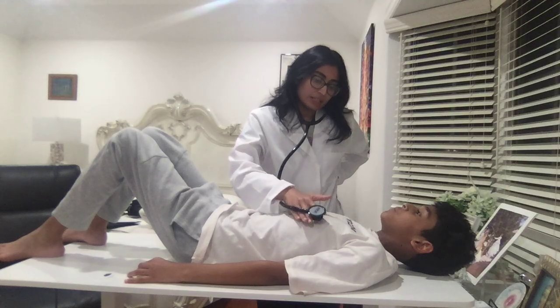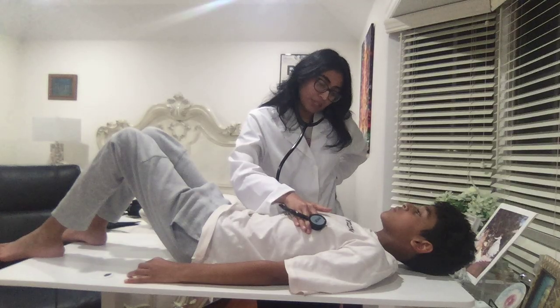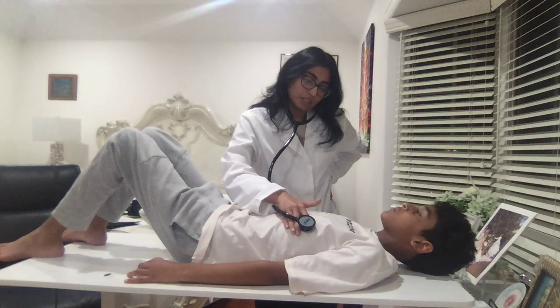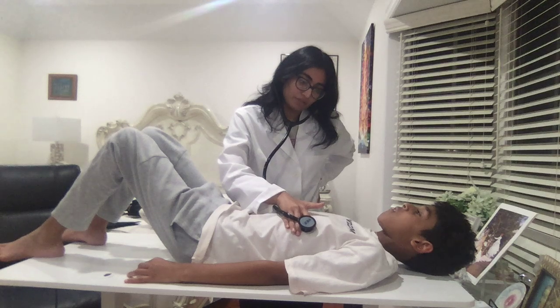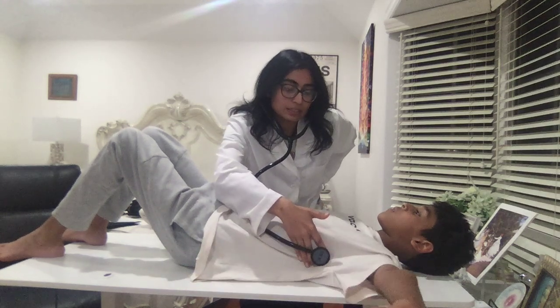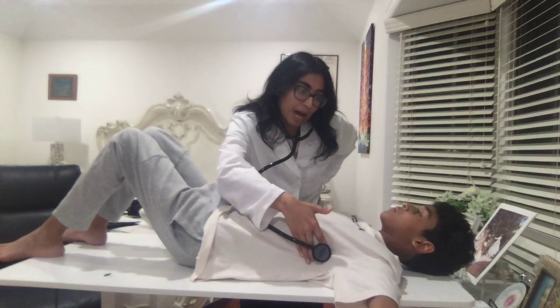Good. And then the fourth intercostal space is the tricuspid valve, left side, peristernal. Then the fifth midclavicular intercostal space, left side, we are listening to the mitral valve. And then again, could you lift your arms slightly? We're going to listen to the axilla sound using the bell, and it's the third intercostal space, mid-axillary, left side.